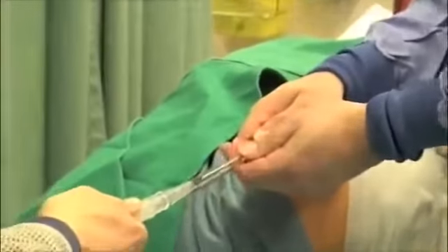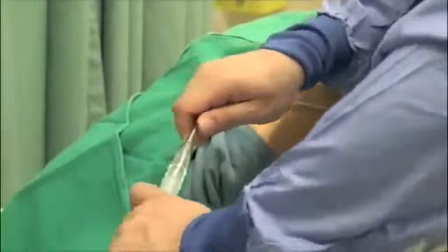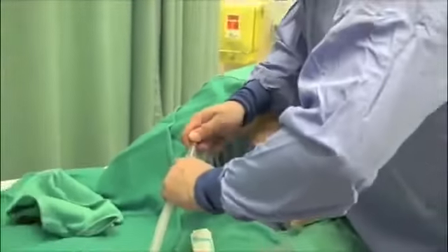Connect the chest tube to an underwater seal apparatus, the Pleurovac. Apply waterproof tape to the connection.